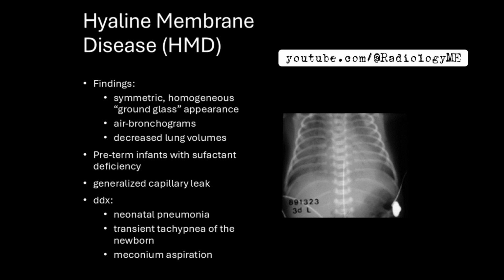In this case, the clinical scenario of a preterm infant with respiratory distress, coupled with the classic radiographic findings, points to hyaline membrane disease. This baby would likely benefit from surfactant replacement therapy and supportive care, which can significantly improve outcomes in cases like this.